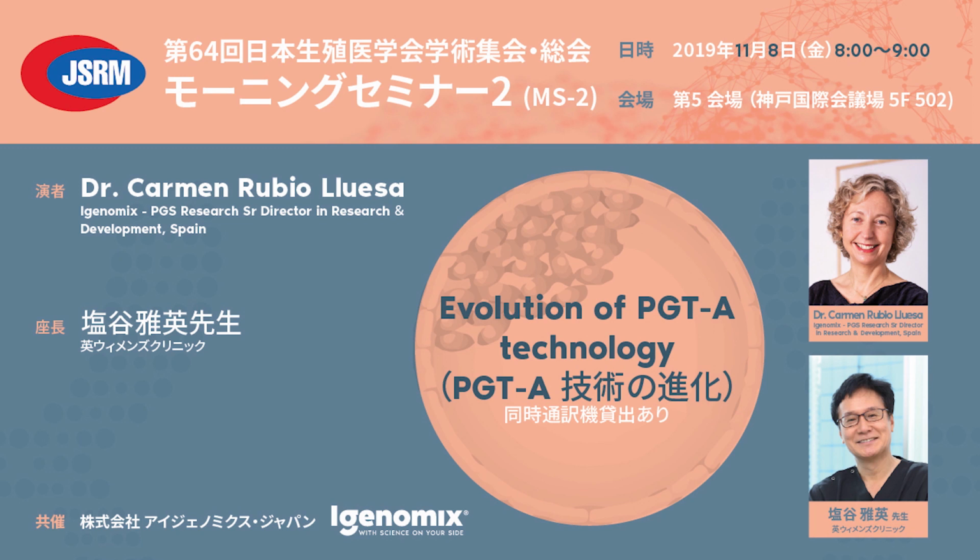biopsy on these embryos. There is a rescue possibility, and for some countries that are very familiar with the trophectoderm biopsy, for sure some of them will choose to do the trophectoderm biopsy on these embryos. So I think there are going to be different options depending on the patient, the doctor, and also the country. Okay, thank you.